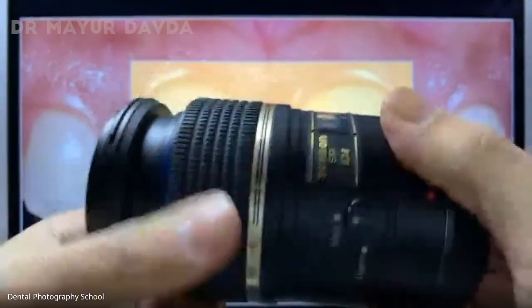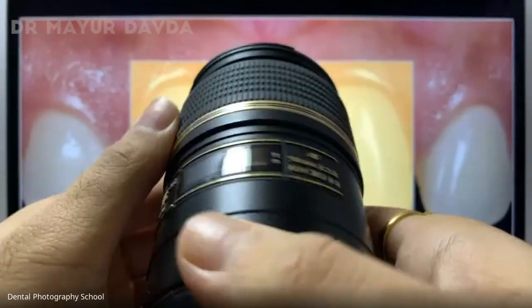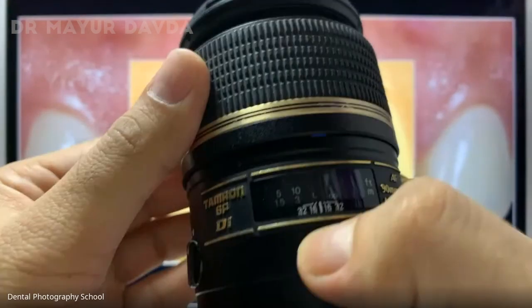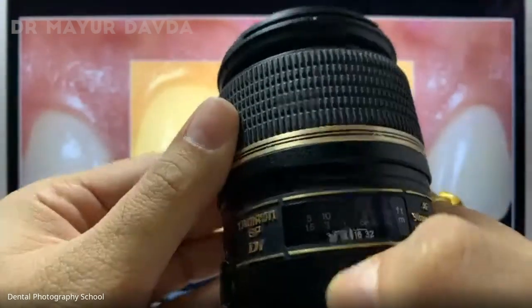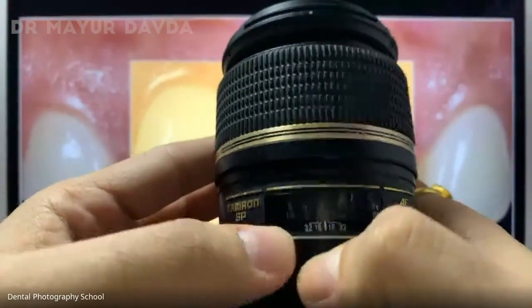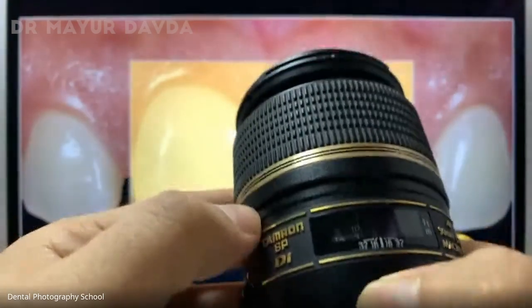Because it's very plasticky, the make is not good, and the most important reason is you cannot see the magnification ratios clearly. Can you see that you are not able to see the magnification ratios clearly? You can see the 5 and 10 over here, I believe, but there are numbers above 10 also, which even I can't see.